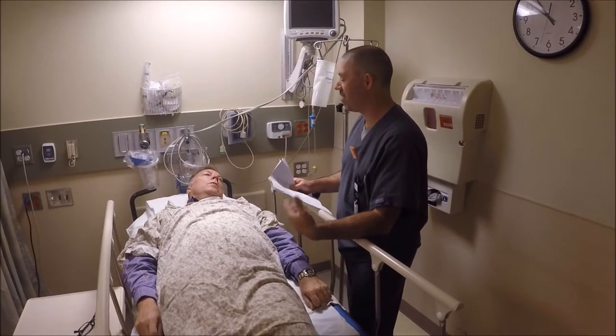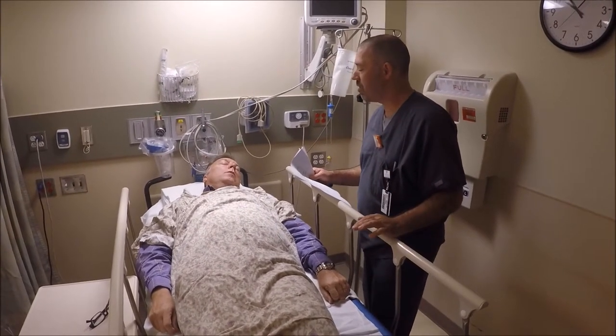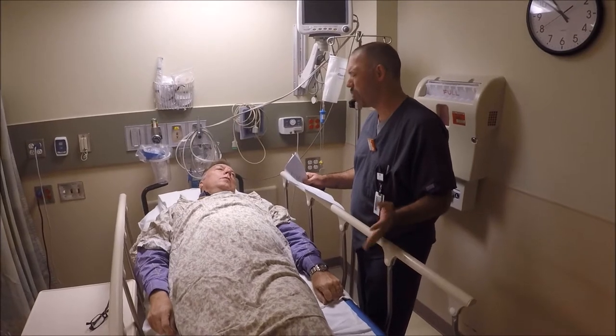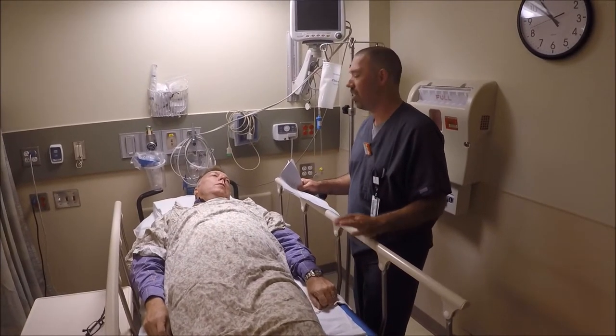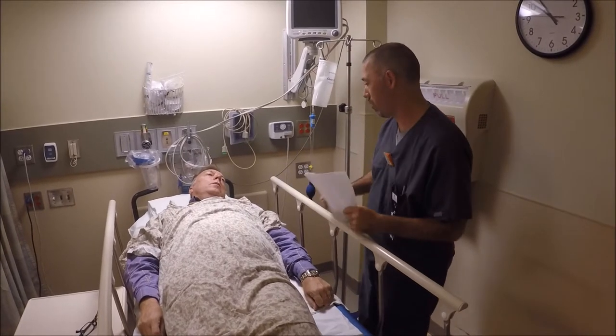Like I said, the doctor's asked us to get a portable chest X-ray on you. We're just going to take a look at your heart and lungs. I'm going to get a few things ready, but we're going to put a hard board behind your back for a couple minutes. We'll try to make it as quick and as easy as we can. It's going to be slightly uncomfortable, though, for a couple minutes.